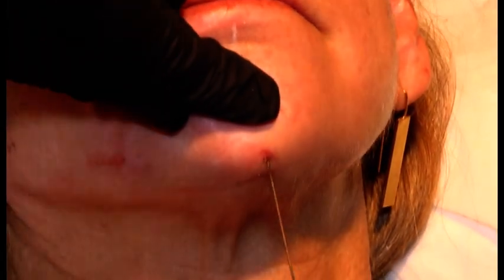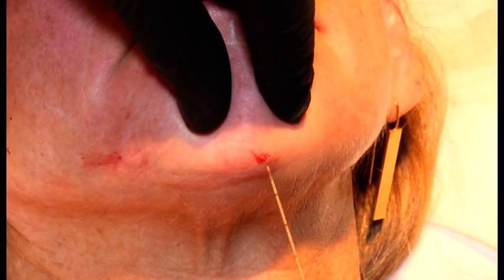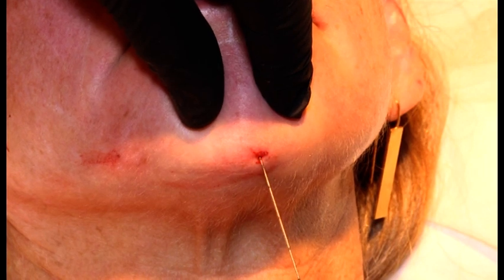Now, from the medial entry point, I can also go submuscular. If I can find the entry.